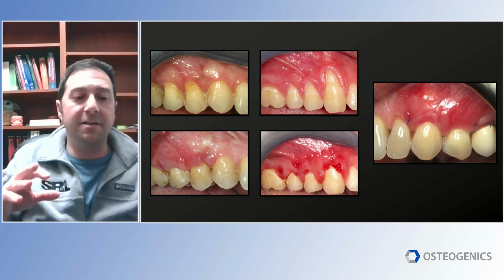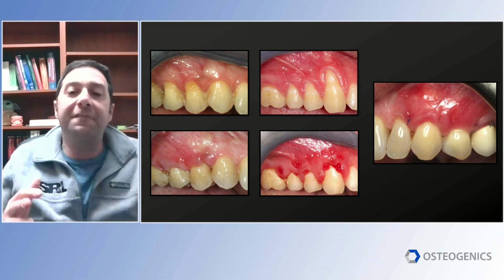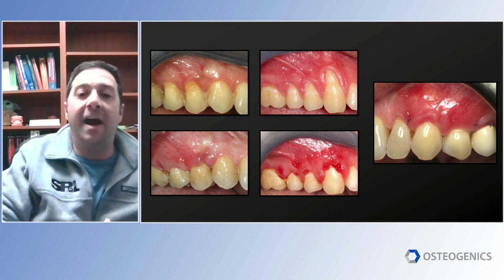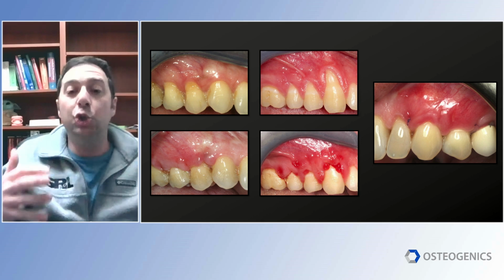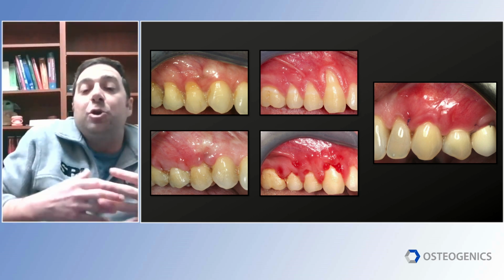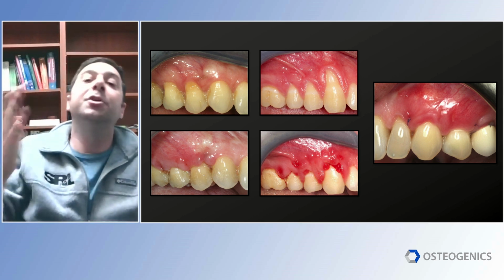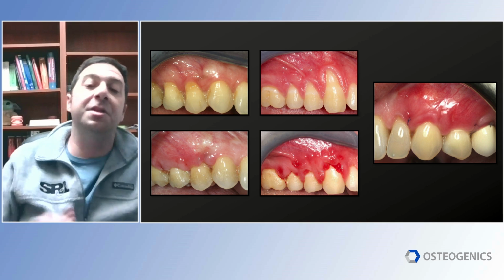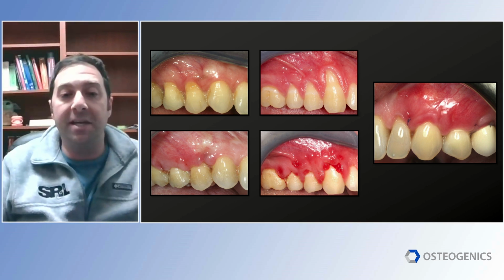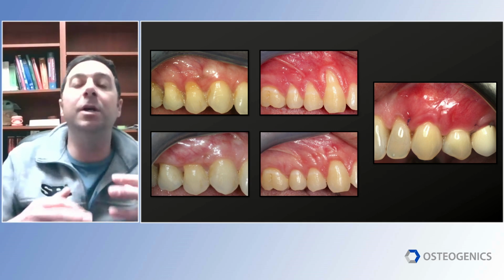It's not that, again, other allografts don't work, but on the left, these are traditional allografts that I've used in the past, and these are 2-week post-ops from those procedures. And again, do they look great? No, they're healing well, and this is where a patient will come back and I'd say, "You're healing just great, Mrs. Smith. I'll see you in another 6 weeks, and look, everything will be good." And lo and behold, yes, they would heal well.